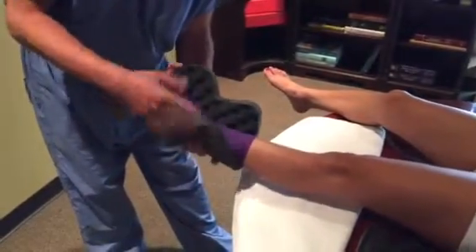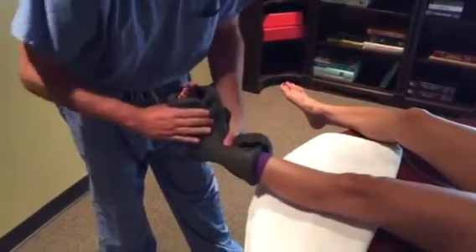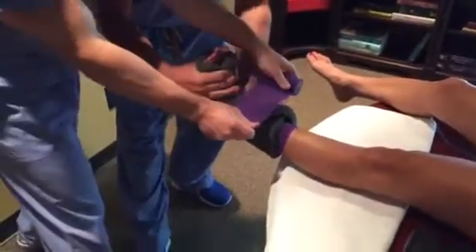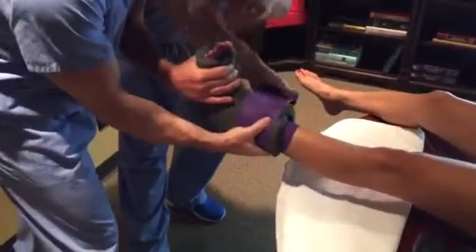The next step is a two-person job. We take — and as you can see — we'll roll this over, roll the top and over. These are sized according to the patient in many of the traction boots. And as you can see, we've got the toes showing.